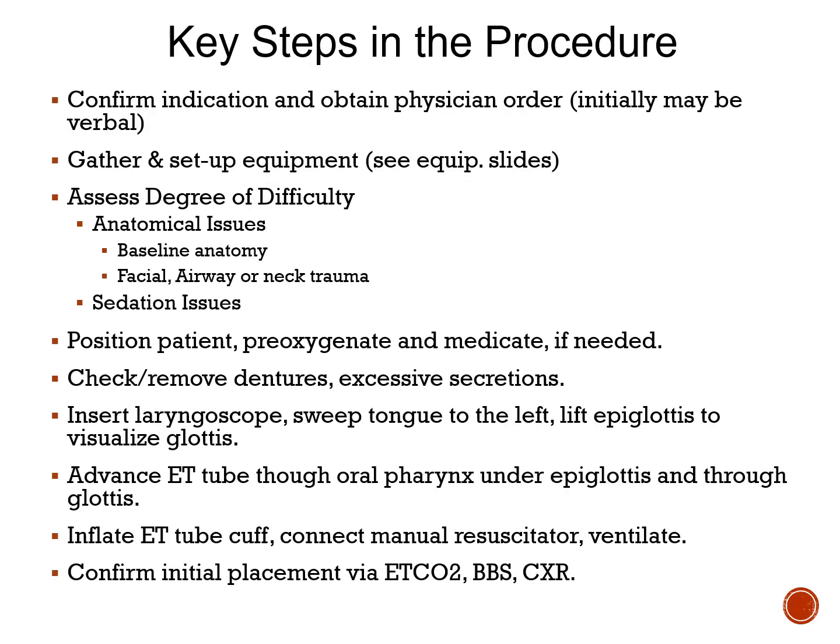Some key steps in the procedure involve the following: confirming indications and obtaining a physician's order, gathering and setting up the equipment. And again, I have a separate slide on just equipment. Assess the degree of difficulty. And again, sometimes you're not going to know until you're there. Sometimes there are clues that you could look at in advance.